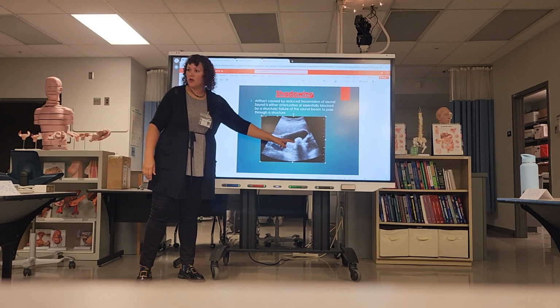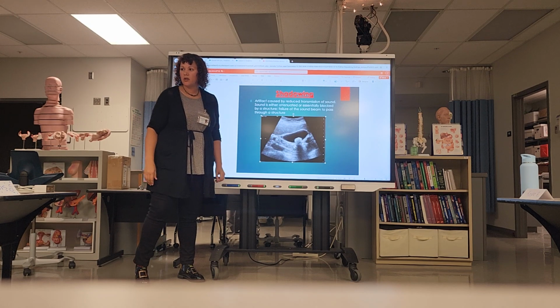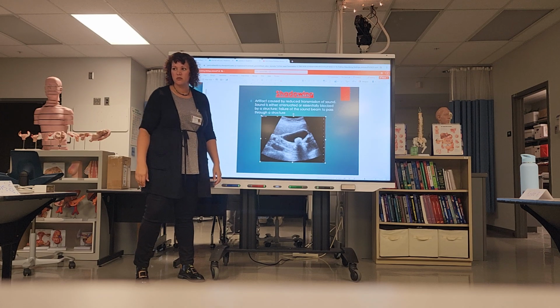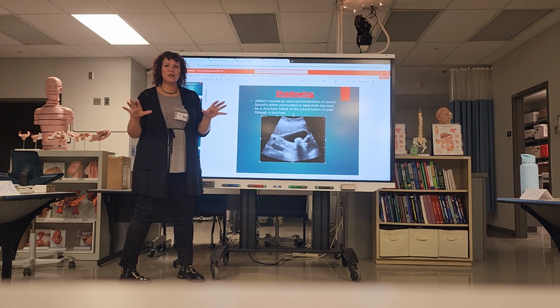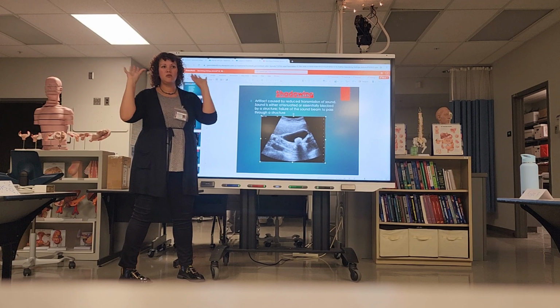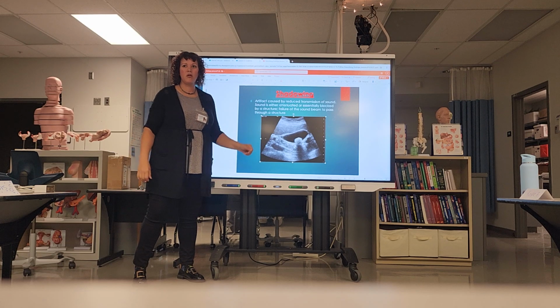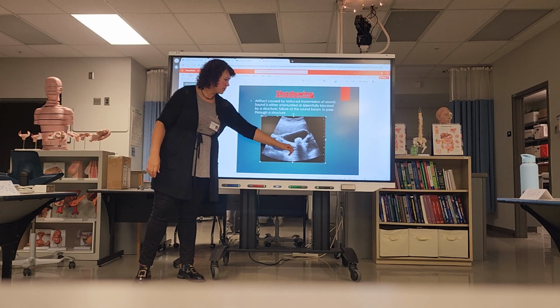So if this gallstone moved around, which I'm sure that it does, you would call it a mobile echogenic shadowing structure. So we don't ever identify what the pathology is by name, because that would be us diagnosing, and we do not diagnose. So we're not going to call this a gallstone. We're just going to call it an echogenic shadowing structure.